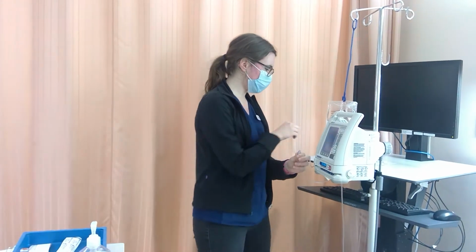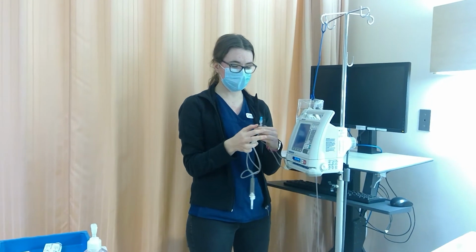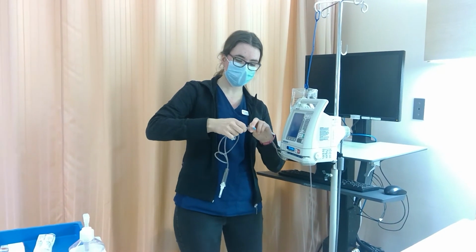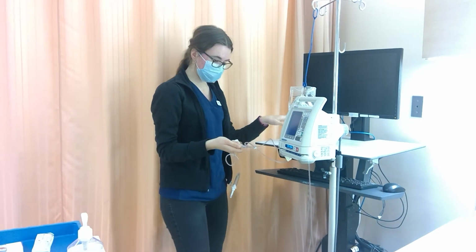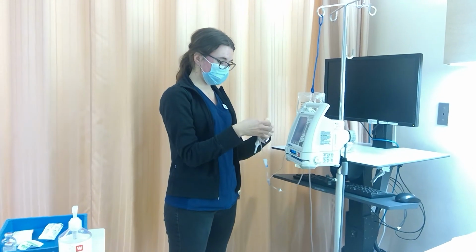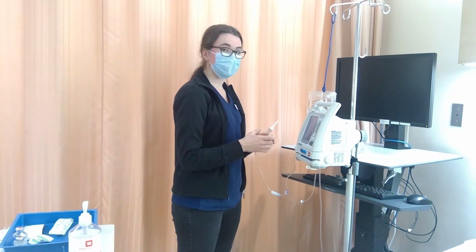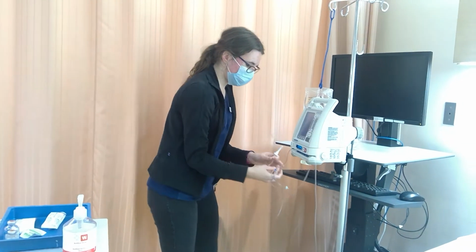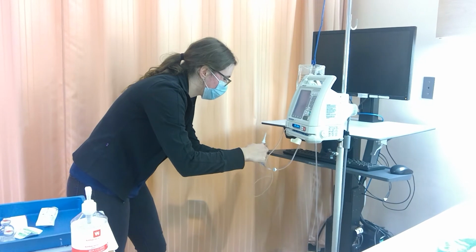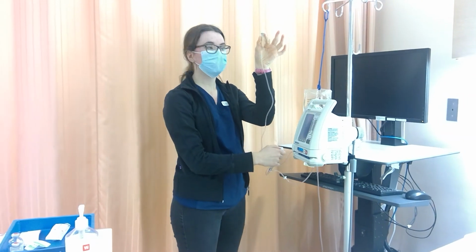So now that I've cleaned that for 30 seconds and I've let it dry, I'm going to take my tubing here and I'm going to safely uncap without contaminating. I'm just going to connect those together. And so the way that I like to back prime is the way that I was taught in lab. Some people like it, some people don't, but for me I find that it's more efficient, and I can also make sure that I'm giving the right dose of medication. So I'm just going to unclamp here, and I'm just going to let it back prime. Awesome. And so we have it at about half to two-thirds here.